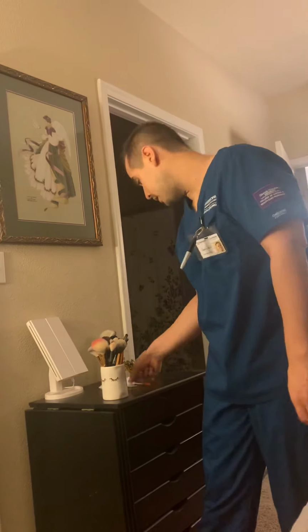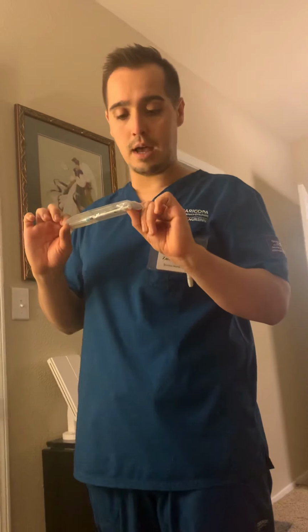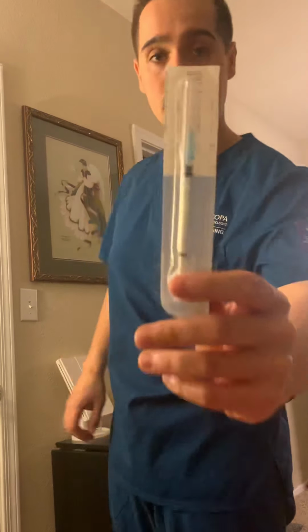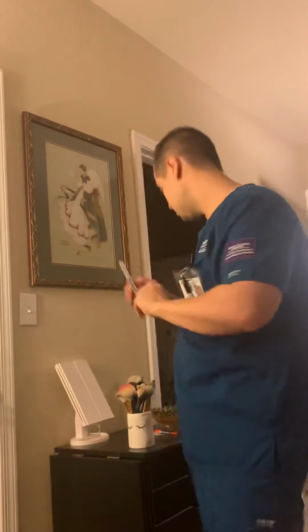And an example of an intradermal needle is going to be this. So we have a 25 gauge by 5/8 inch. So this is the largest needle that you would use, but here's an example of an intradermal needle.